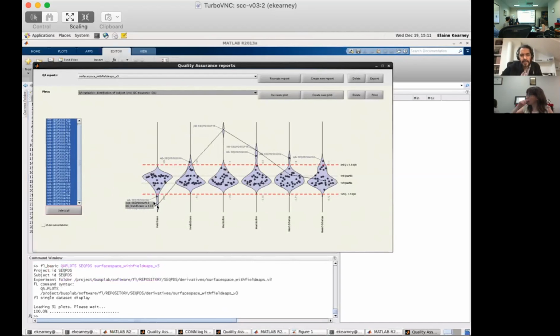And the rest of the subjects, just hover over them to see the range. It's 300 and something. Okay, so it has removed close to half of the data points for that subject, and it shows a lot of motion. This is one of those problematic subjects that you can keep, but keep an eye on it. And if the first level measures are very noisy and bad, perhaps we should remove it.